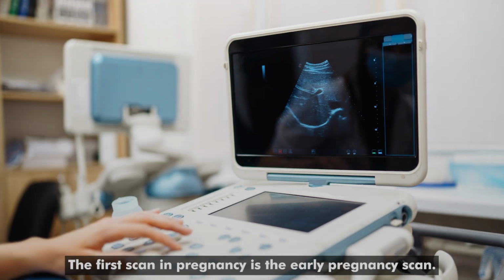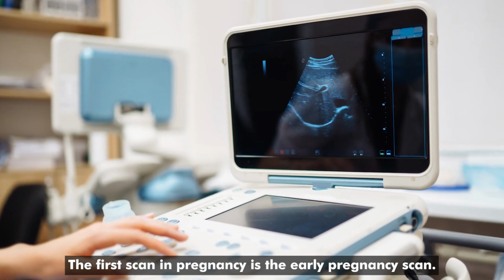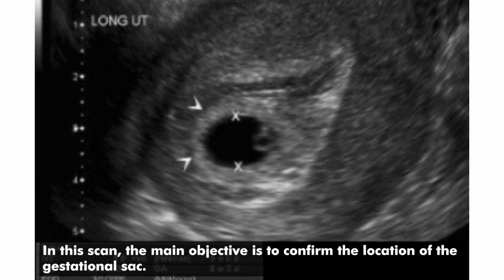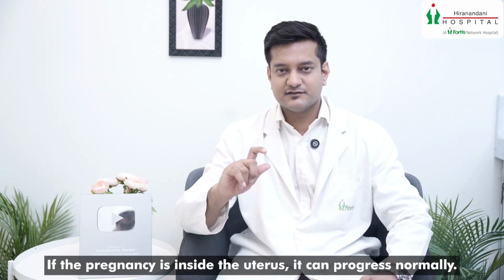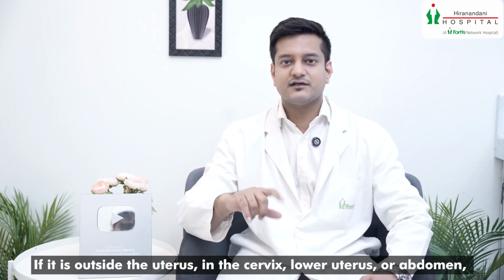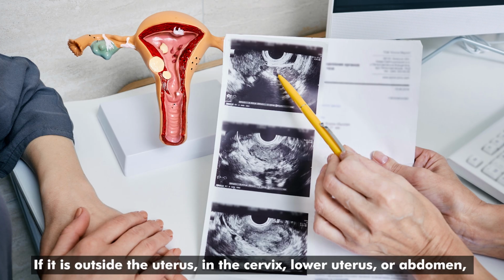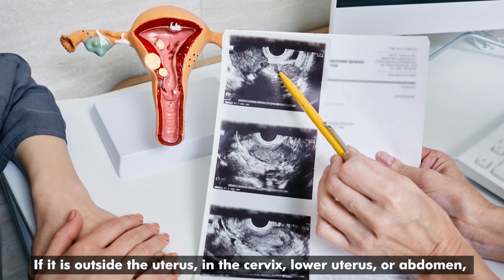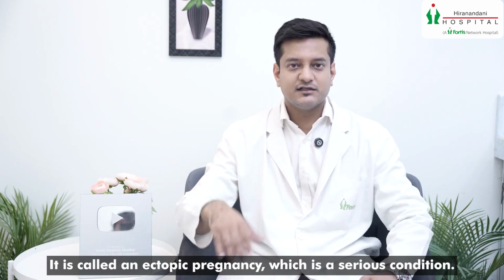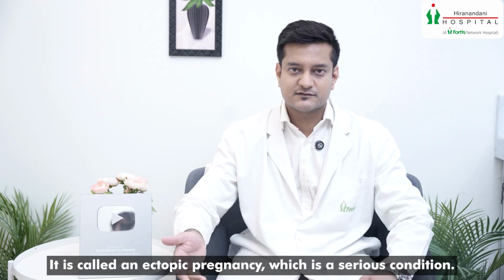The first scan which is done for the pregnancy is the early pregnancy scan. In the early pregnancy scan, the main objective is to see where the pregnancy sac, the gestational sac, is, if it is in the uterus or outside. If the sac is inside the uterus, the pregnancy can progress normally. But if it is at an abnormal location, like outside the uterus, in the lower part of the uterus or in the cervix, sometimes abdominal, that is called ectopic pregnancy, and it's a complication which has its consequences.